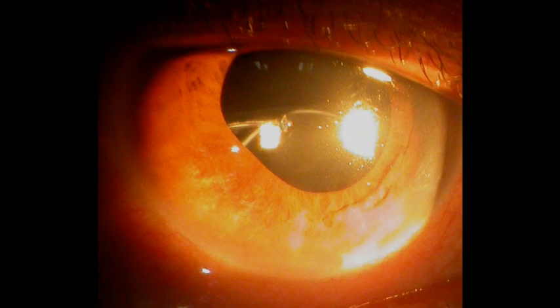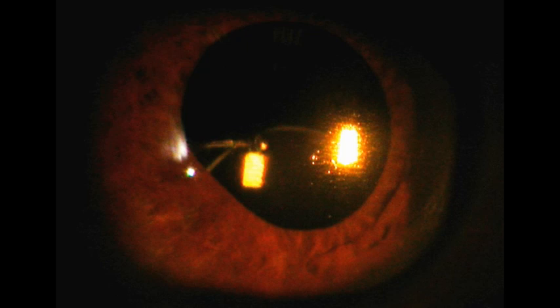Methods: a middle-aged male presented with subluxated capsular bag with multi-piece acrylic foldable PCIOL secondary to pseudoexfoliation syndrome. Pre-op visual acuity was counting fingers and improved to 6/18 with aphakic correction. In situ repositioning with double haptic scleral fixation of IOL was planned under local anesthesia.